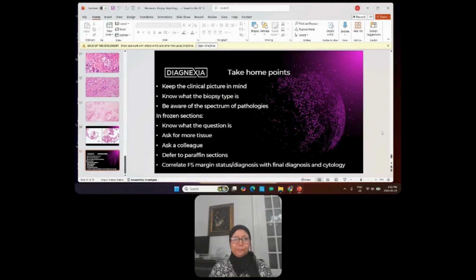So it is recognized that it happens, and what we used to do is correlate it with them, and of course that's just taken in as a learning and the way it is. But the discrepancies between cytology and the histology are not infrequent.